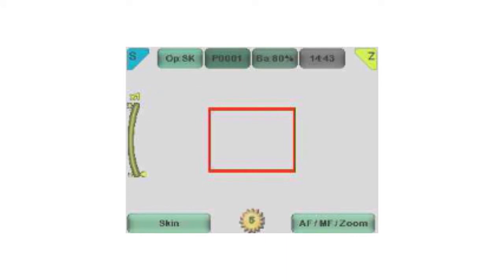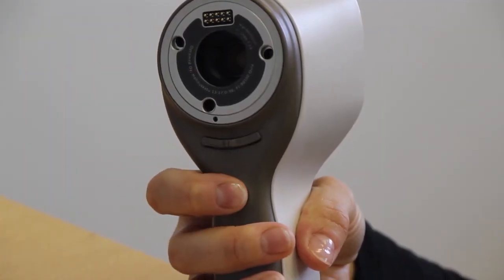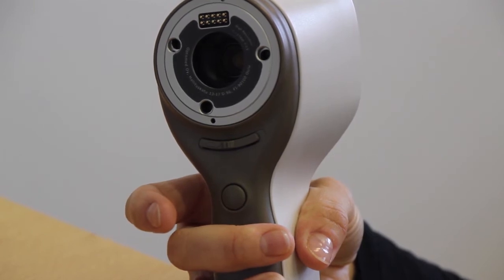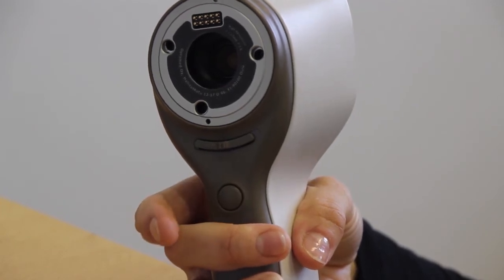We will now look at some of the other menu options. Shoot mode: with autofocus, there are two shoot modes you can select from the SK menu — Normal and Auto. When normal shoot mode is activated, the shutter operates like a standard digital camera with a step trigger. Pressing the button halfway first focuses the image, and the image is taken when the button is pressed all the way down.